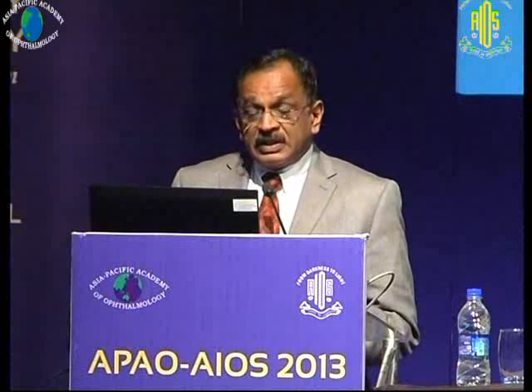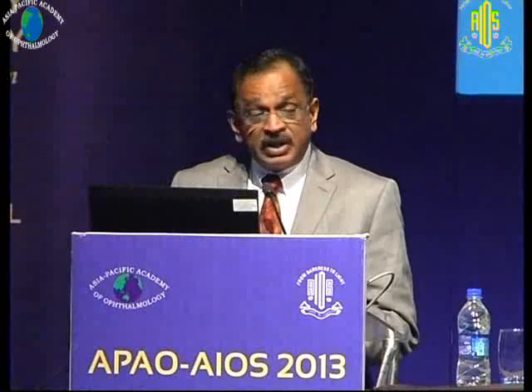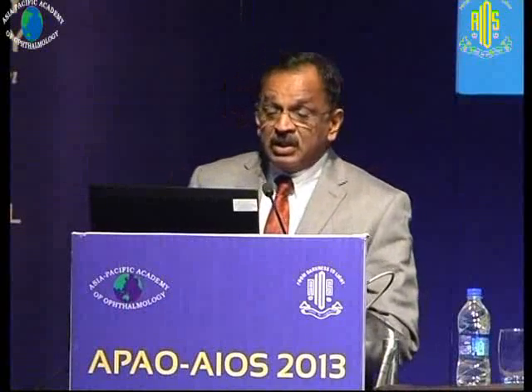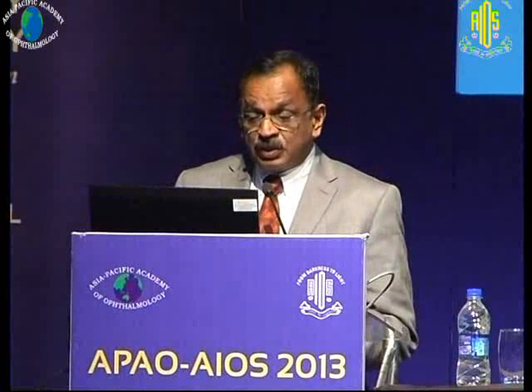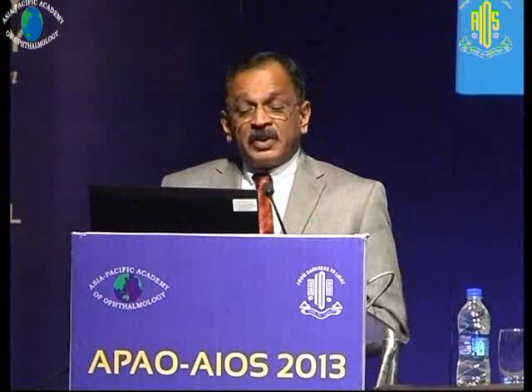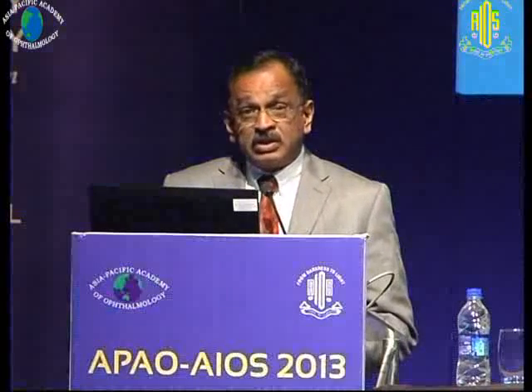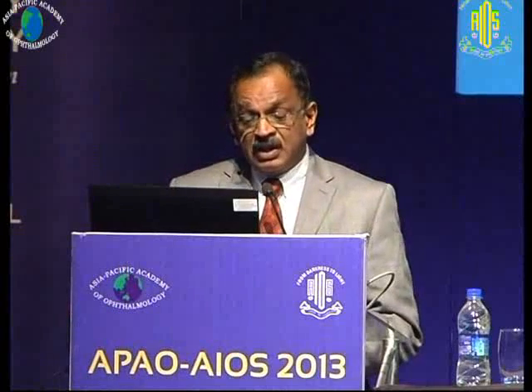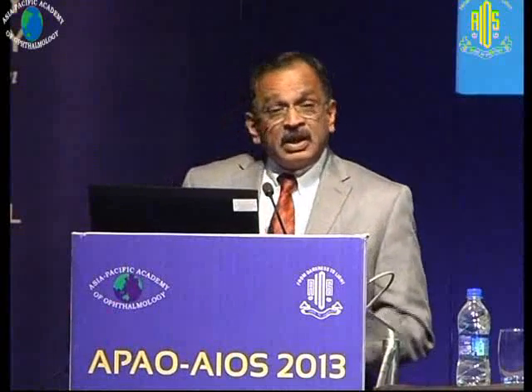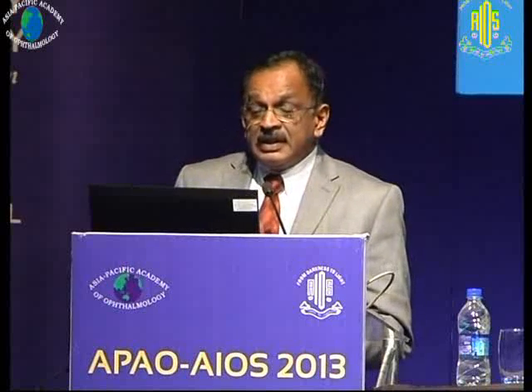And when you do an extensive retinotomy or retinectomy, it is preferable to excise the flap of the retina anterior to the retinectomy, because this can be the site of reproliferation. Again, the circumferential contraction type of anterior PVR, you could release it by making sure that you make a good vitreous base dissection, along with the placement of some radial cuts on the vitreous base.